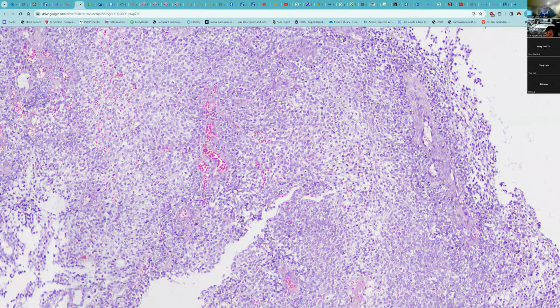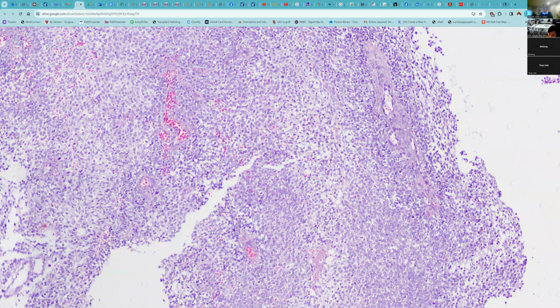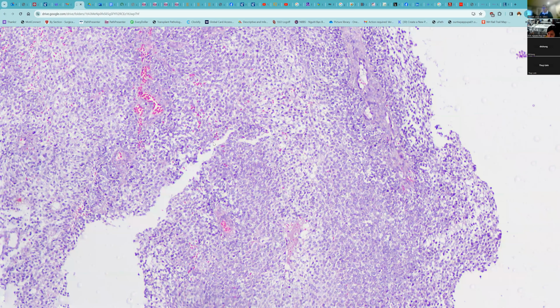Usually a vascular tumor, especially in the sinonasal area, those are usually younger patients. Angiofibroma is a very young person's type of diagnosis and usually males. So this lesion has the appearance of a potentially high-grade tumor because it's quite undifferentiated.